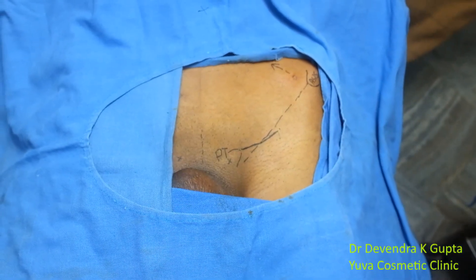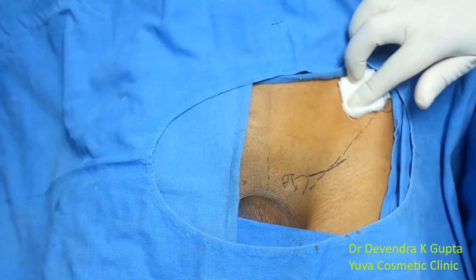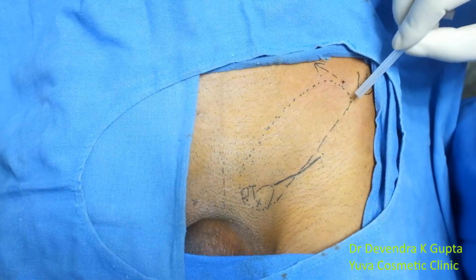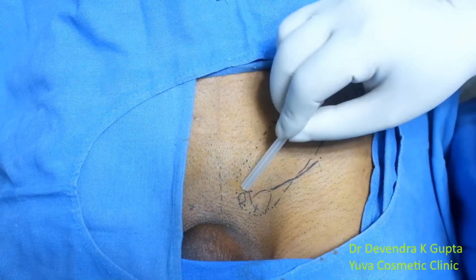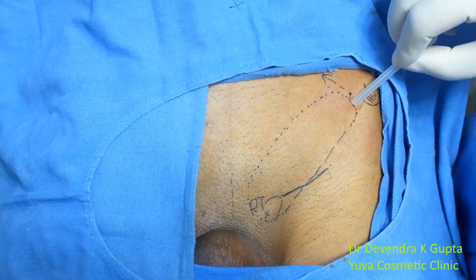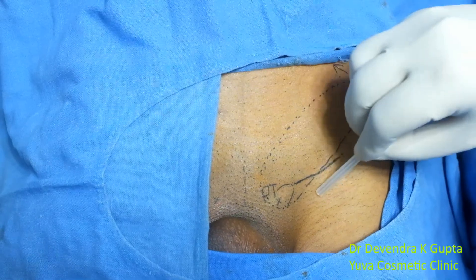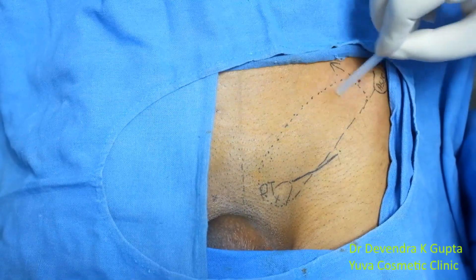This will block the ilio-hypogastric and ilio-inguinal nerves. Remove the needle, massage the area, and wait five to ten minutes. After five minutes I am examining the area of analgesia in this patient — I have marked the dotted line showing the anesthetized area.